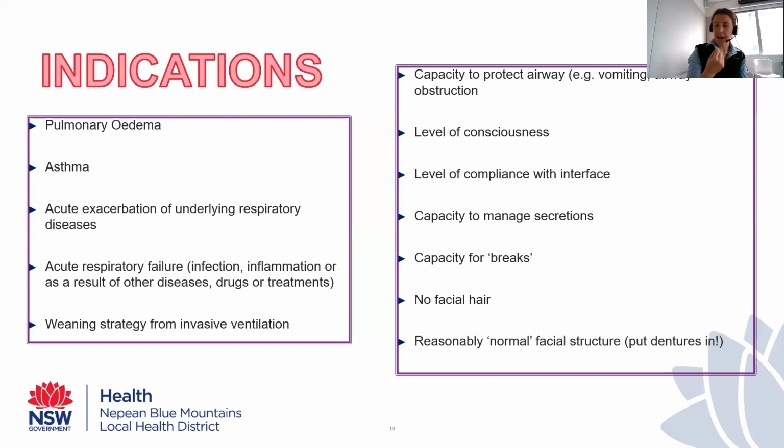Dentures. So with our patients who have dentures, if they're a full set of dentures and they're well fitting, pop them in. Because they actually give structure, particularly to the lower jaw.